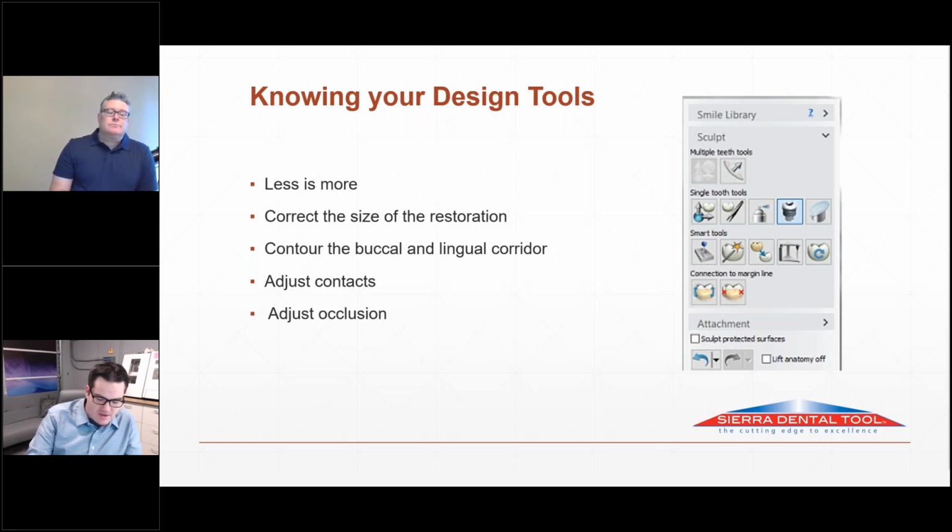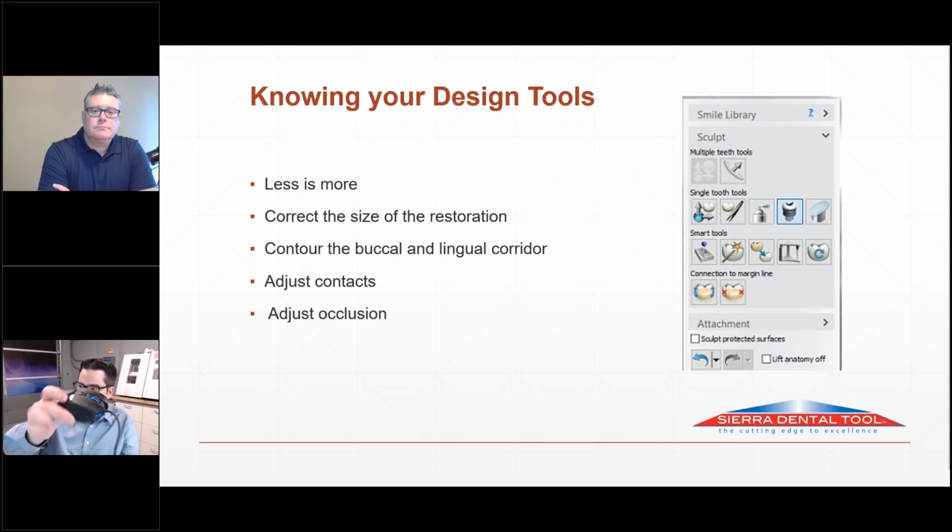And I actually have a kind of offside tip for designing. Read the manual, figure out what the hotkeys are. If you don't know what a hotkey is, it's like a computer shortcut that you can use to select tools or have the software do something. And then go on Amazon, spend $30 and buy a programmable gamer mouse that has buttons, and you can actually map those hotkeys to those buttons.